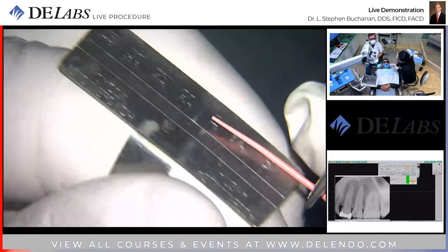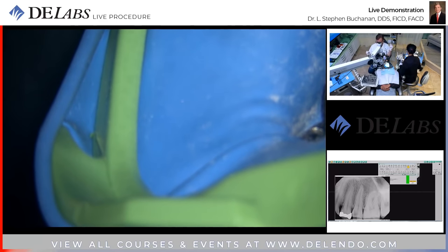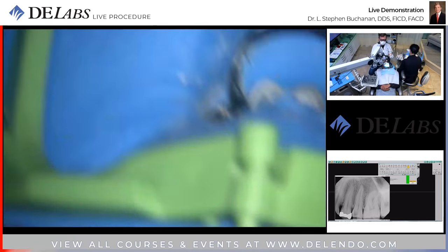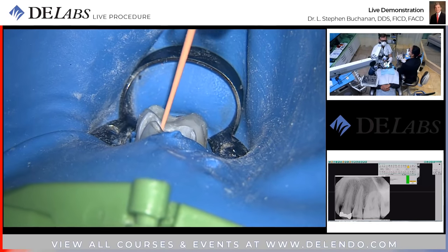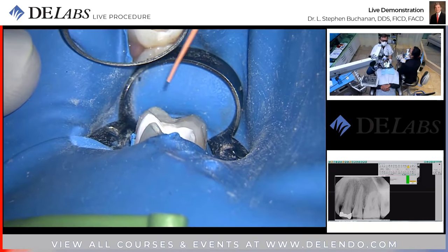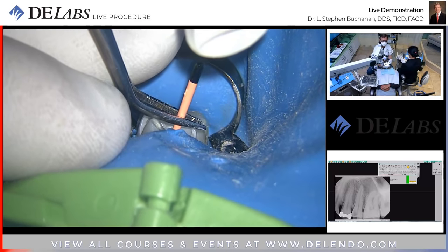Well, am I fitting close enough here? I am not. Okay, we're going to go to an 04 taper. Could I have a 40 04? Thank you. I may have to put a shaping file down there if this isn't going to behave when I'm cone fitting.